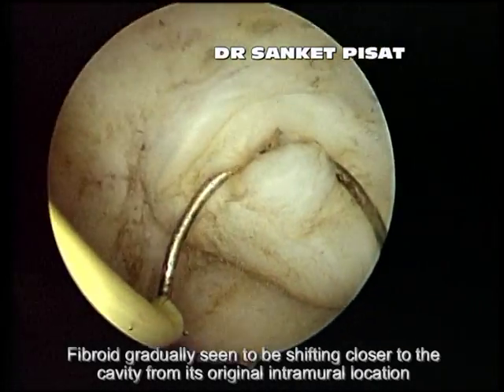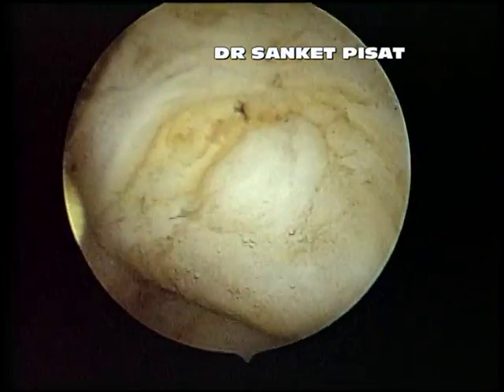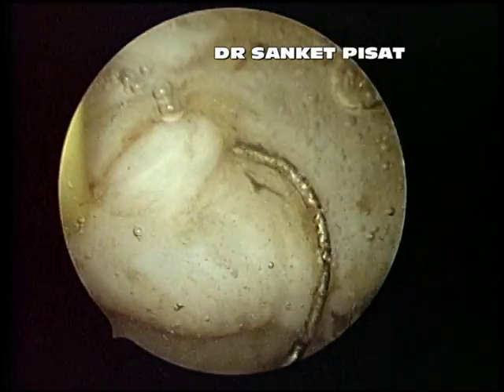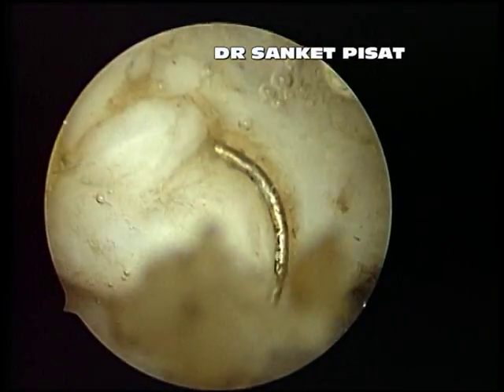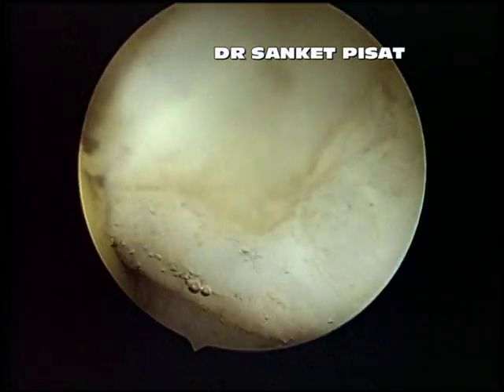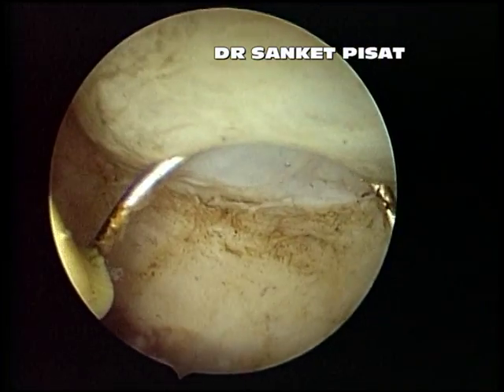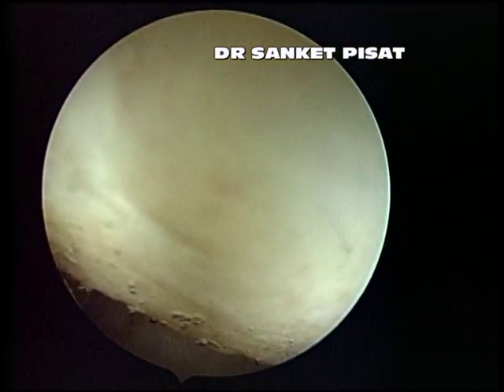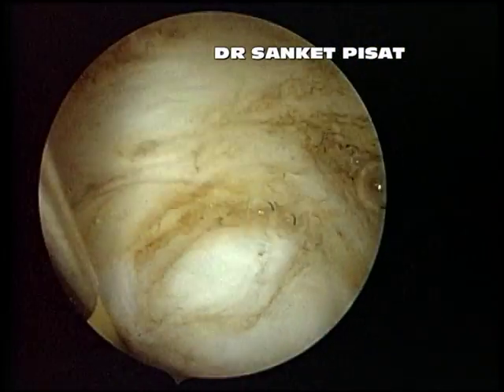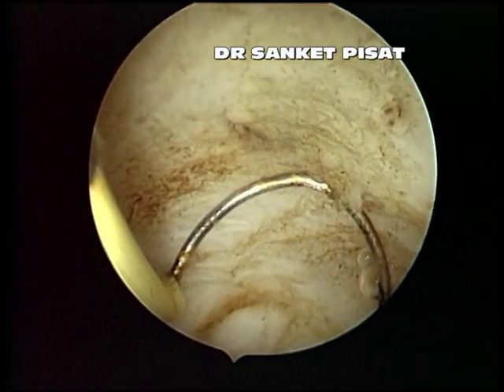By this gradual pushing and pulling, the fibroid is gradually seen to shift closer to the cavity from its original intramural location. The process is meticulously continued slowly and steadily till the fibroid can be gradually lifted away from its attachment, thereby effectively converting a more advanced or a more deep intramural type of fibroid into a more submucous one.